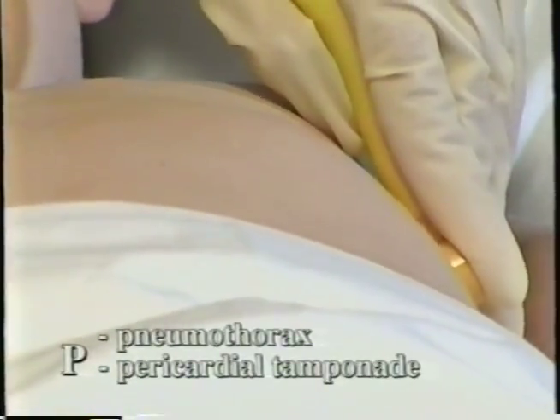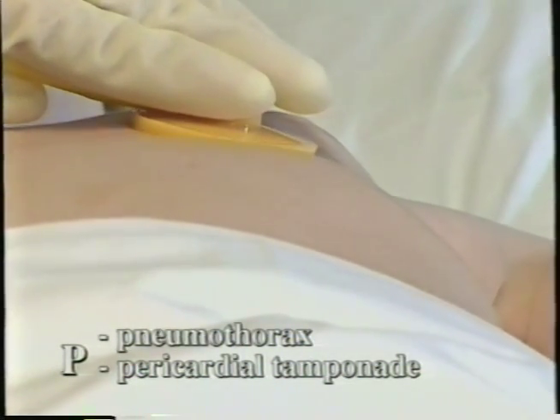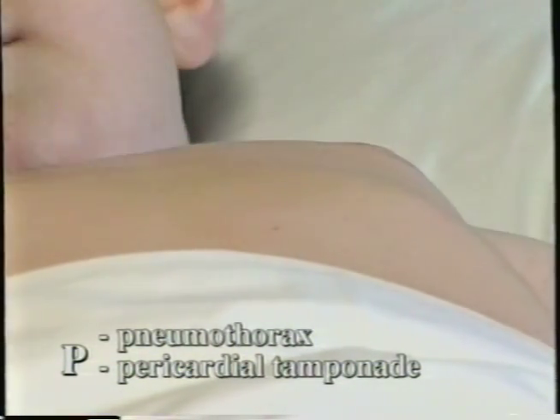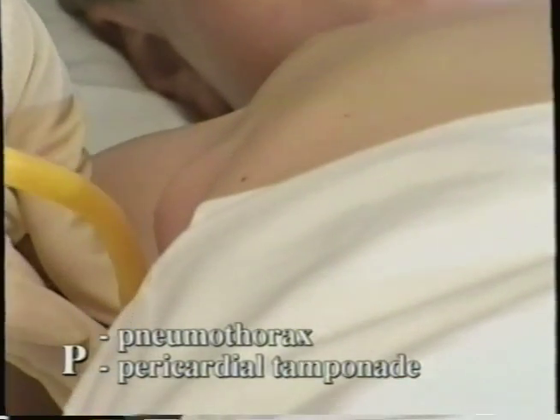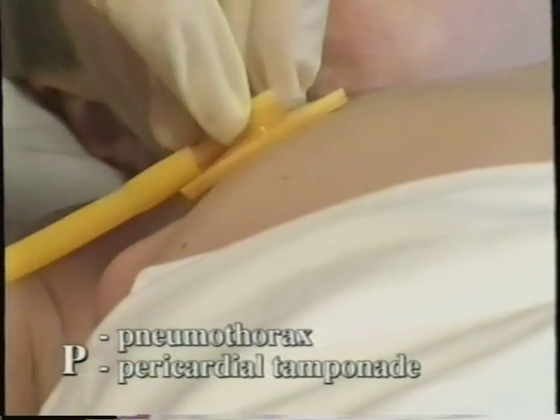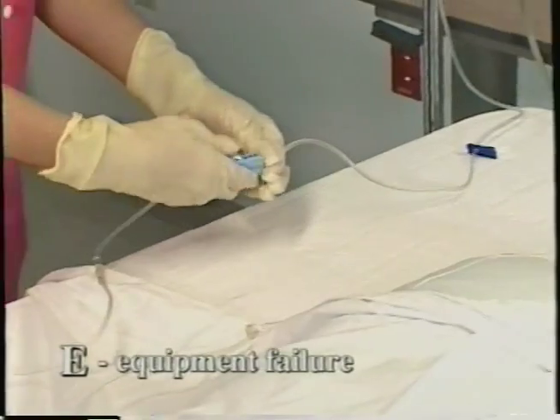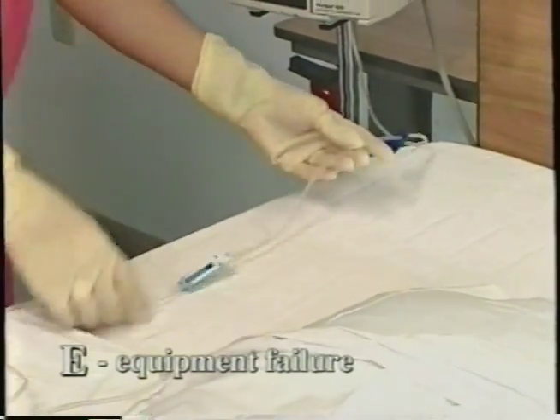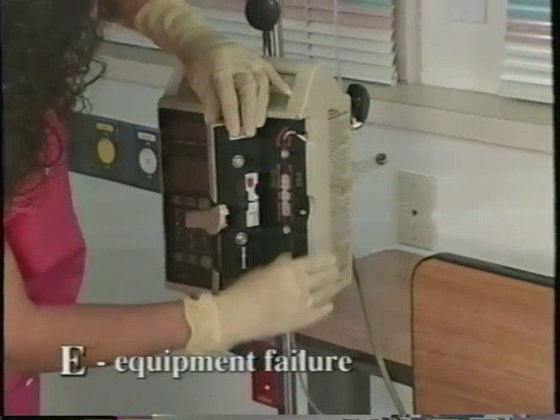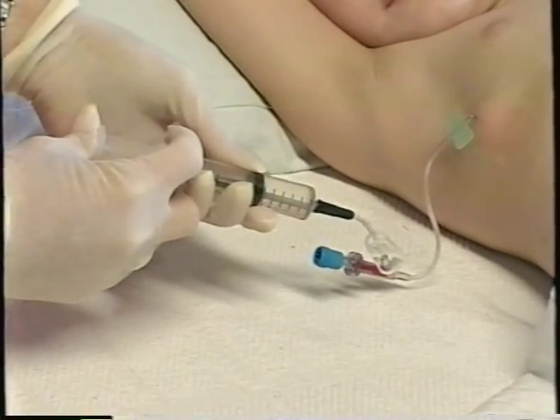P, in this case, stands for pneumothorax or pericardial tamponade. Perforation or erosion of the central vein by the central venous catheter can cause a pneumothorax, hemothorax, or hydrothorax. Erosion of the catheter through the atrium can result in acute pericardial tamponade. And E represents equipment failure. Connection leaks or damage to the catheter or pump system can cause problems. Disconnect and examine equipment and pumps. Manually flushing the catheter often helps to define the problem.